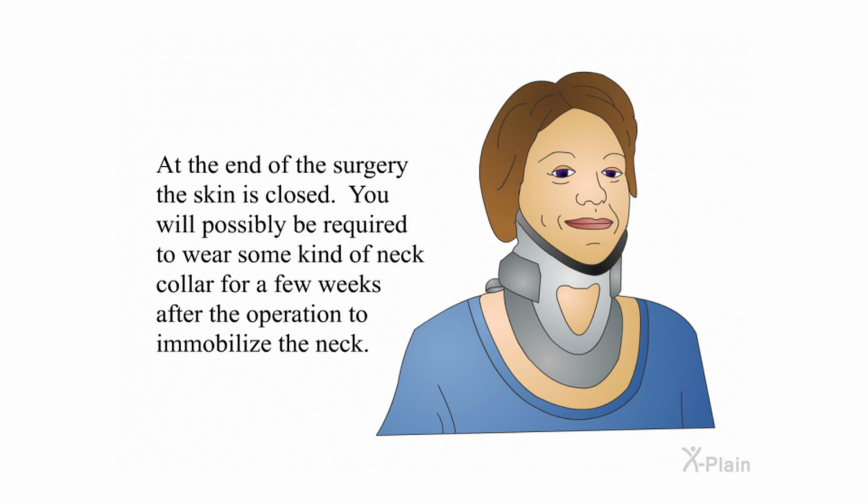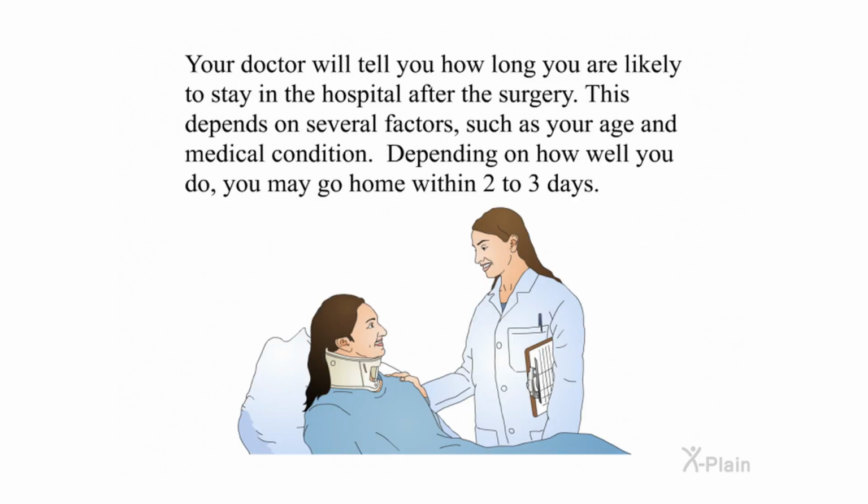At the end of the surgery, the skin is closed. You will possibly be required to wear some kind of neck collar for a few weeks after the operation to immobilize the neck. Your doctor will tell you how long you are likely to stay in the hospital after the surgery. This depends on several factors, such as your age and medical condition. Depending on how well you do, you may go home within 2 to 3 days.